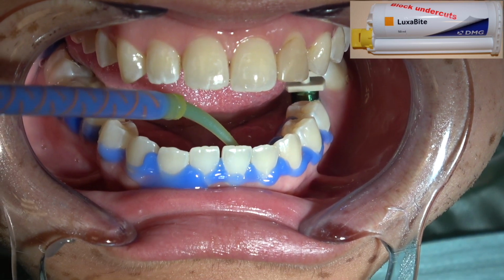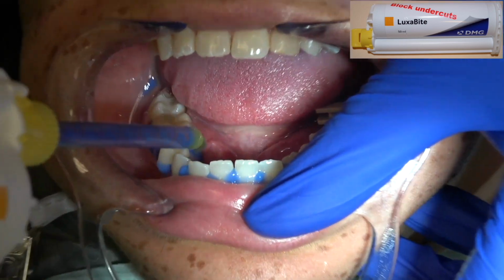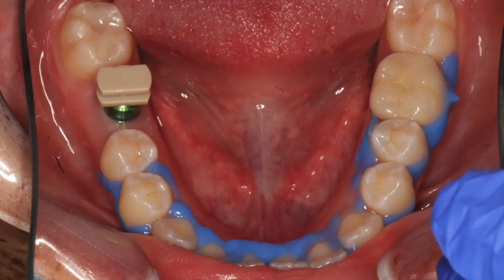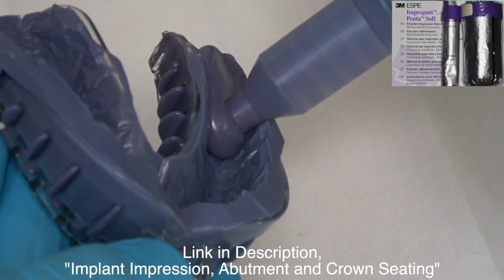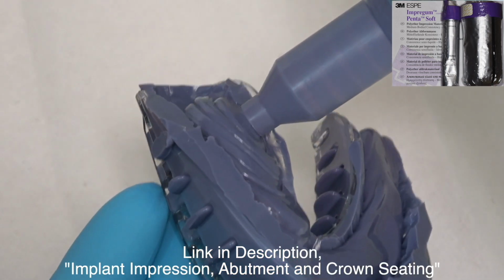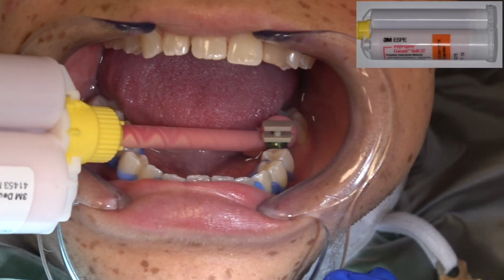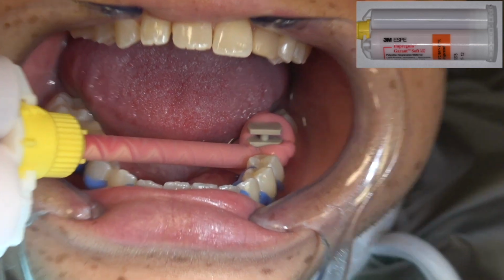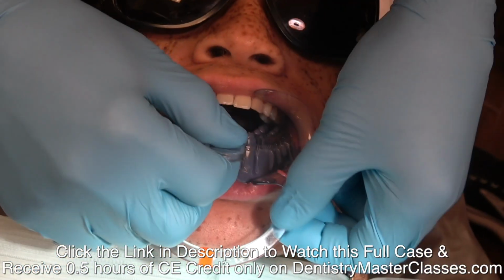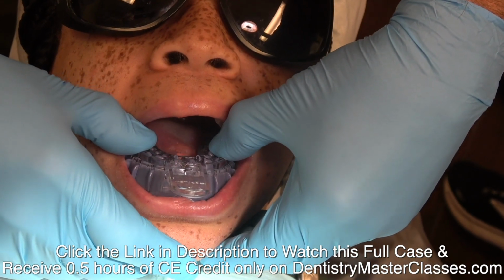This is Blockout Luxabite, because that polyether is pretty rigid and you don't want it to lock into any undercuts. So here's the implant, blockout around the rest of the teeth. Custom tray, very important. Then we squirt body material into the custom tray. Then we're going to put the wash material on top of that. Then I'm going to squirt wash material around the implant on both the facial and the lingual or the palatal sides. I want to capture the gingival tissue.